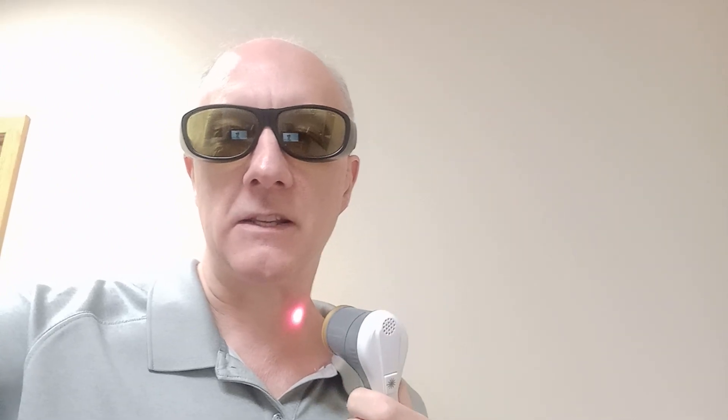I just cannot leave it in one spot like my other lasers. My other lasers are technically cold lasers — even though they don't make anything cold, they do not produce any heat. I can stop that and it just goes back to that regular red light again. So this laser has this red light and then three infrared frequencies, so when it's on there are actually four frequencies. Most people don't realize that cameras like cell phones can detect infrared light. You can take your phone down the street and see which houses have security systems because of the infrared lighting emitted by cameras so they can see at night. Our eyes don't see this — we feel it as warmth — but the infrared energy is there and cameras will pick that up.